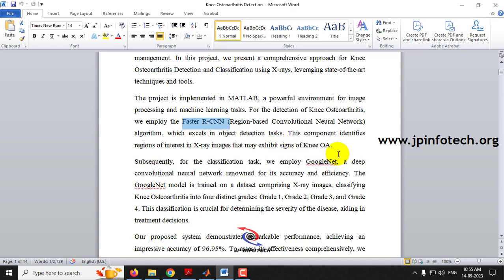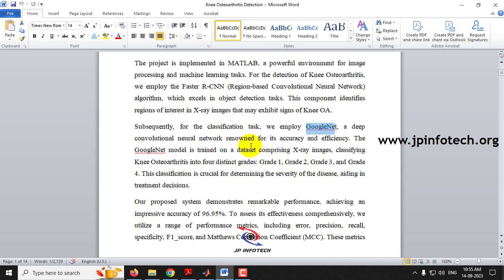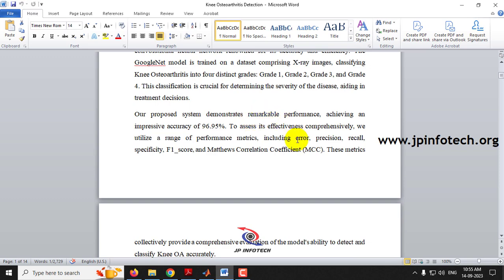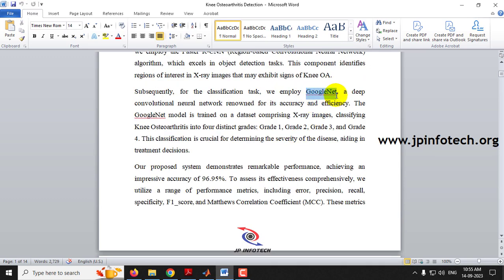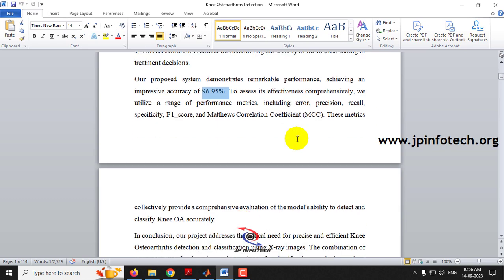One model is Faster RCNN and another one is GoogleNet. Faster RCNN is used for detection of knee osteoarthritis, and GoogleNet is used to classify it into different grades: grade 1, grade 2, grade 3, and grade 4. Our proposed system achieves 96.95% classification accuracy using GoogleNet, and we will be showing performance analysis parameters like error, precision, recall, specificity, F-score, and MCC values.